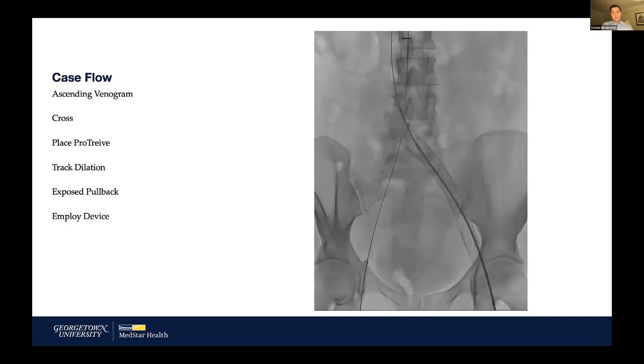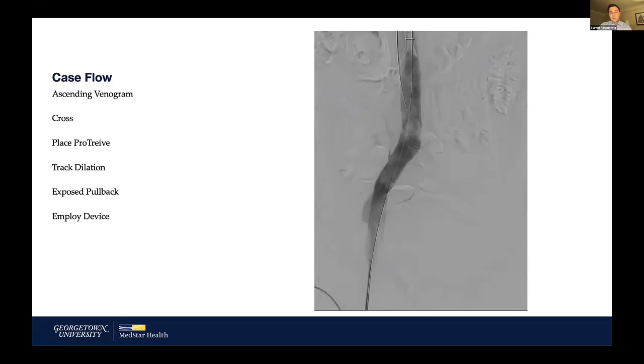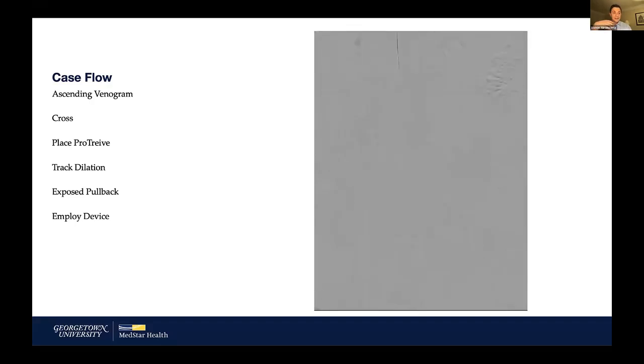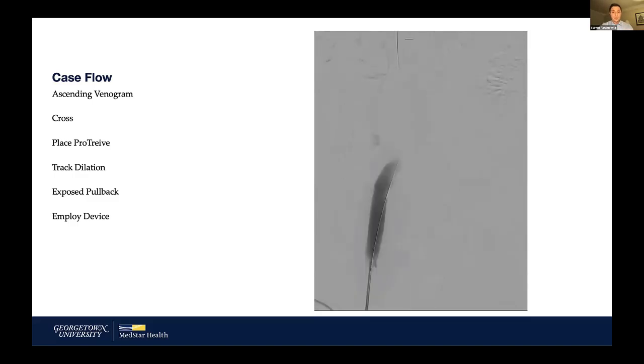You want to go until there's resistance, pass all the way through when there's not, and keep moving back and forth. Mid-case, I started to see material being generated — sheets of material and small chunks, but not big pieces. It's more like thin sheets being shaved off, like that cheese slice. You can see it gathering at the distal margin of the stent and up in the Protrieve sheath.